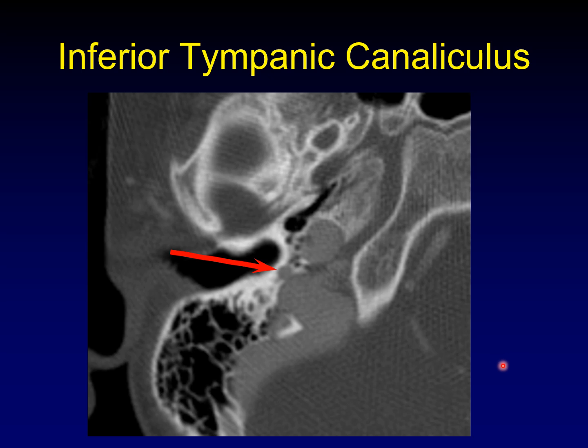The inferior tympanic canaliculus you usually can't see at all, so I'm intentionally showing you an example where the ITC is enlarged. The reason it's enlarged here is that it normally carries the inferior tympanic artery and the inferior tympanic nerve, which are alternately called Jacobson's artery and Jacobson's nerve, and it's carrying it up into the middle ear cavity. It becomes enlarged in situations where there is an aberrant internal carotid artery and the flow is carried not through the carotid foramen, but rather through the inferior tympanic canaliculus as an enlargement of the inferior tympanic artery. Normally, this one you can't even see, so it's not usually confused with a fracture.